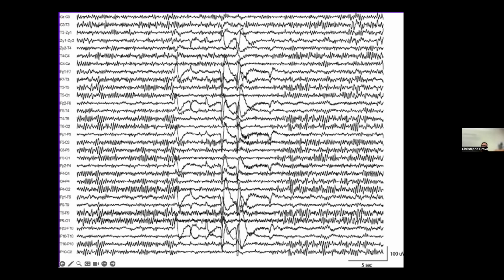Yeah, we see a lot of alpha activity. We see alpha activity here. So when are the eyes closed and when are the eyes open? Yeah. So this is typically what we call the alpha reactivity. So when you install an EEG and you want to make sure it is correctly recording, you ask your subject to relax, to close his eyes. It's going to generate some alpha activity, mainly occipital. If you ask the person to open, of course, you get an artifact because of the eye blink, and you should see some beta activity. So here the person blinks 1, 2, 3, and goes back to alpha.